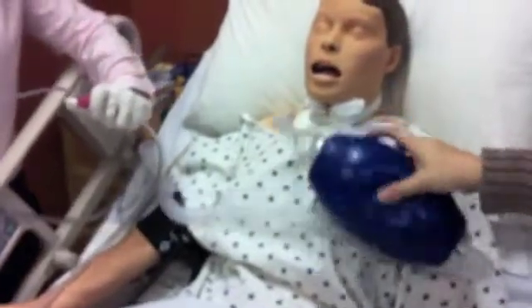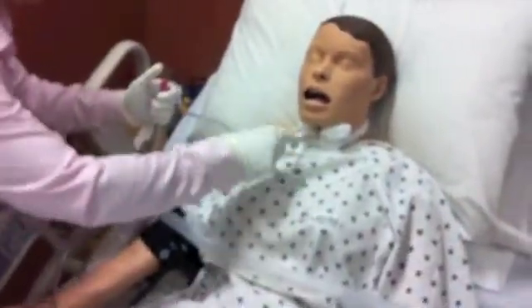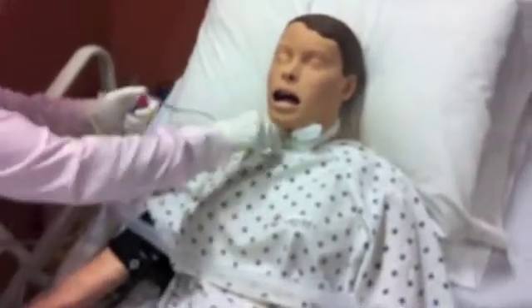Hold your left hand up higher. No suction on the way in. Suction intermittently on the way out and swirl.